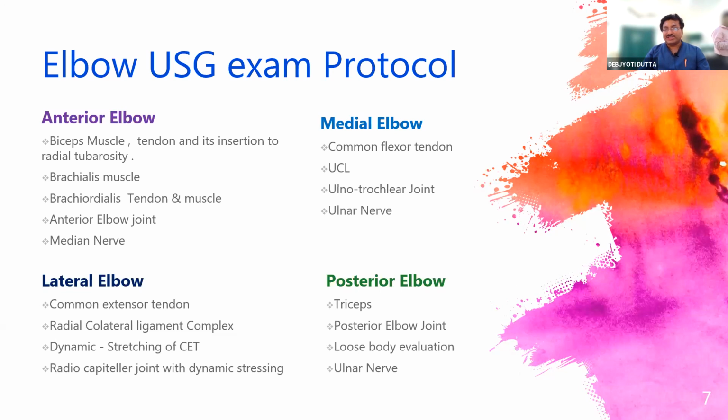Next, we have to check the median nerve as well. So we will be knowing the home view, or in Kanchan's word, home page view of the elbow here. Okay. Next, coming to the lateral elbow.